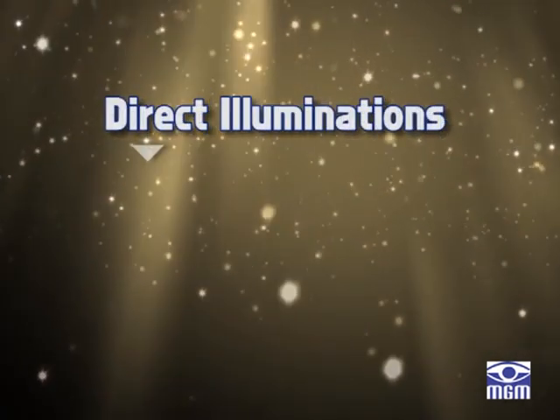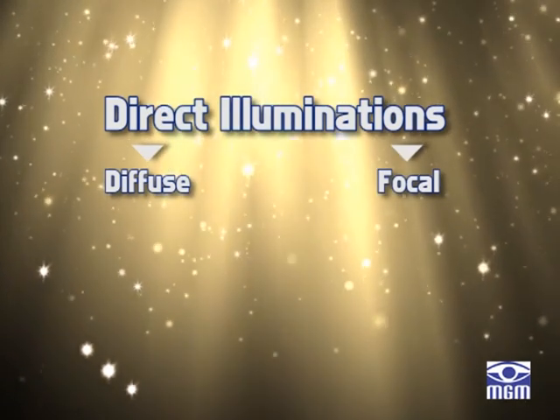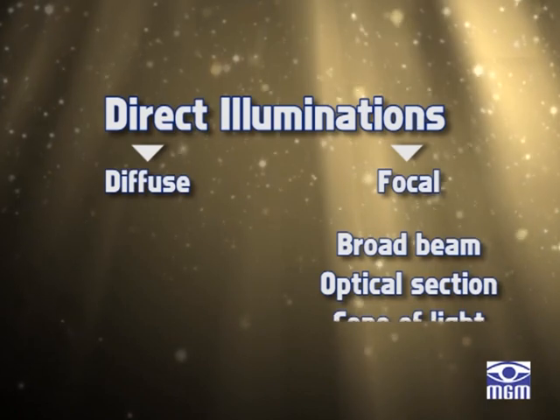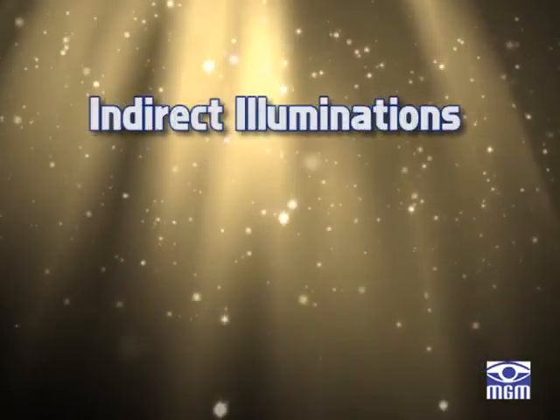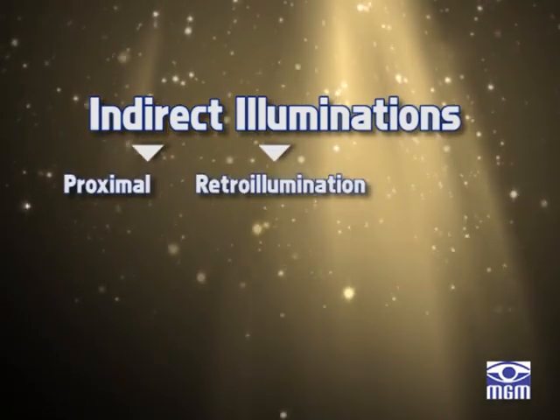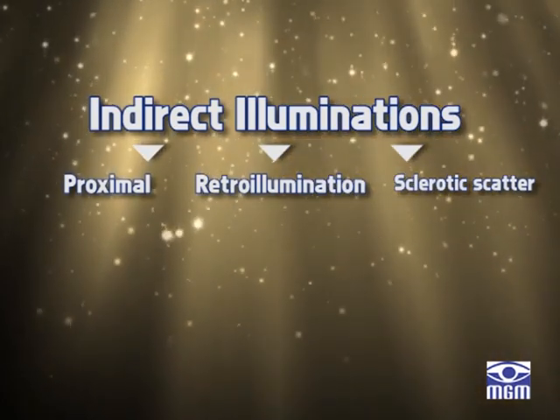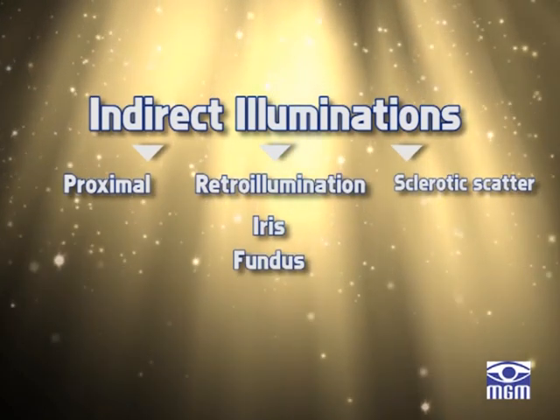Direct illuminations are diffuse and focal illuminations. The focal illuminations are divided into broad beam, optical section, cone of light, and specular reflection. The indirect illuminations are proximal illumination, retroillumination, and sclerotic scatter. The retroillumination is again divided into iris retroillumination and fundus retroillumination.